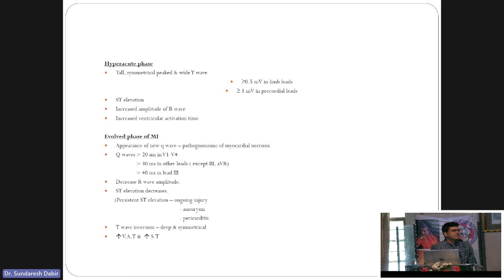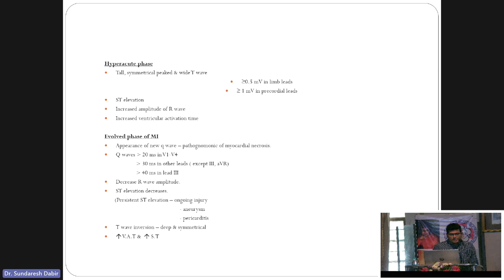These tall, peaked, broad-based T-waves are characteristic of the hyperacute phase, with some ST elevation that can initially be concave upward. As the phase evolves, the ST elevation becomes convex upwards. In the hyperacute phase, there are tall, peaked T-waves with increased amplitude of R-waves.